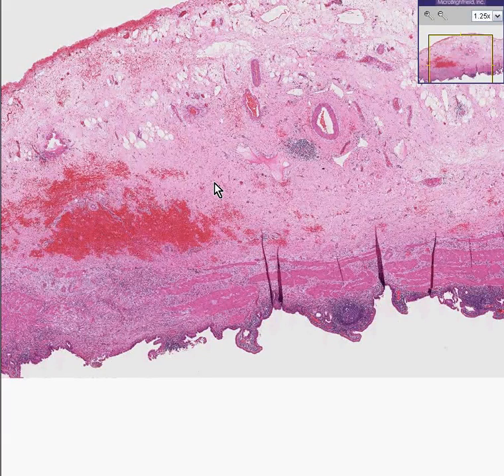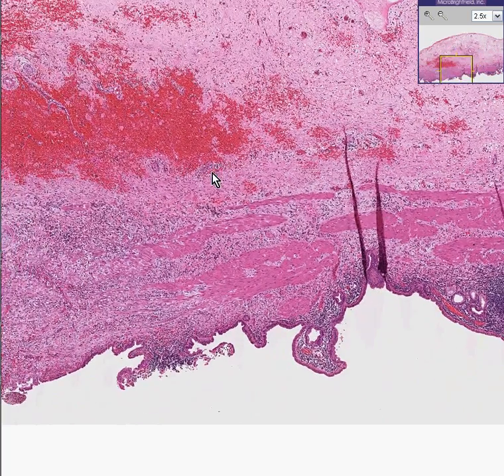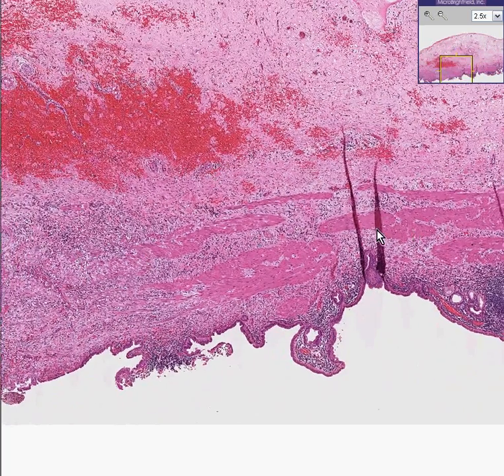This is another great example of our inflammation algorithm. You take a normal organ, like a gallbladder, which this is, by the way, because it has a lot of connective tissue. It has this little band of smooth muscle, and it has a mucosa, which is generally fairly uniform, fairly columnar, but may form little papilla like this, which is classical for gallbladder. You take this gallbladder, you throw in a bunch of lymphocytes, and you have your diagnosis of chronic cholecystitis.